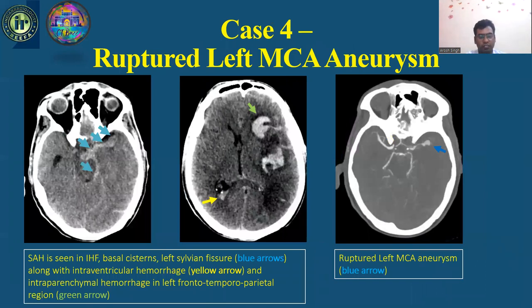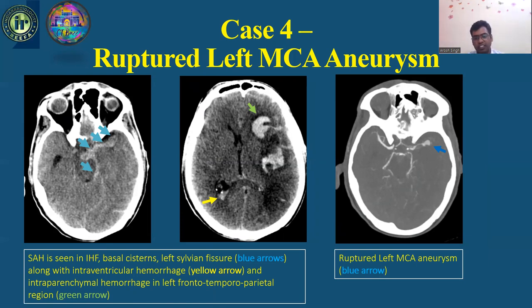Case 4 is a ruptured left MCA aneurysm. On NCCT head, we can see SAH in the interhemispheric fissure, basal cisterns, and left sylvian fissure shown by blue arrow, along with intraventricular hemorrhage shown by yellow arrow, and intraparenchymal hemorrhage in the left frontotemporal parietal region shown by green arrow. On CT angiography, we can see a ruptured left MCA aneurysm shown by blue arrow.